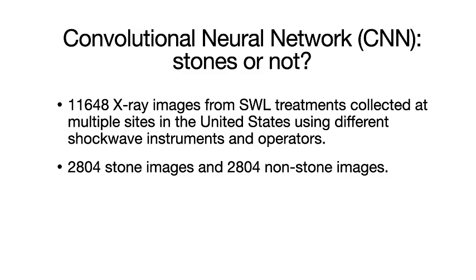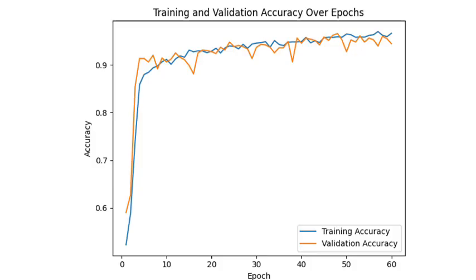So now that you have a dataset, what's next? We trained the CNN using PyTorch. I'm not going to bore you with all the details, but if you read the paper, it's all there. Here is the output from PyTorch showing the relationship between accuracy and epochs during training.